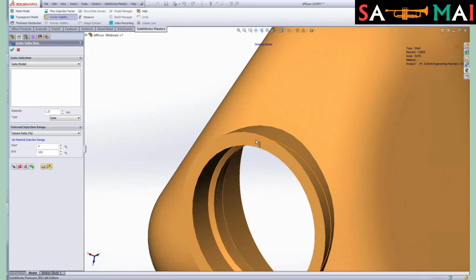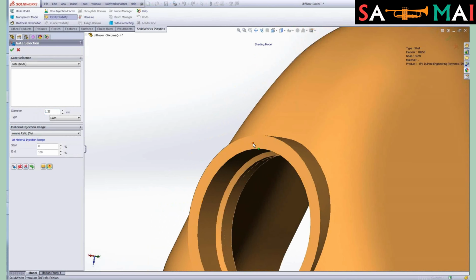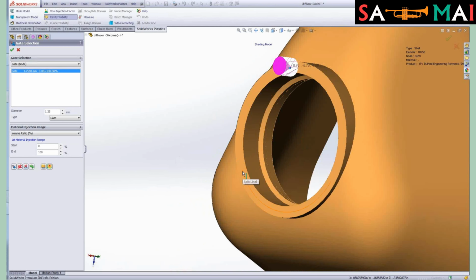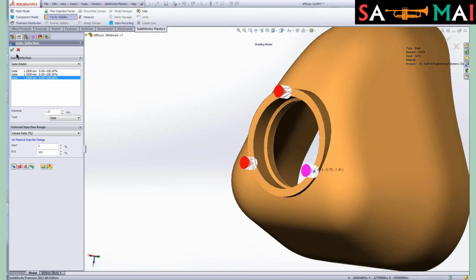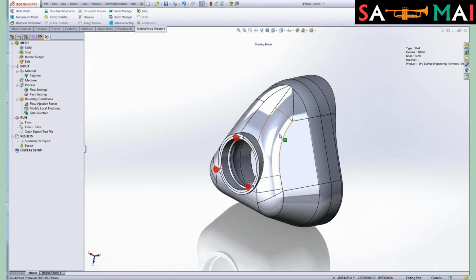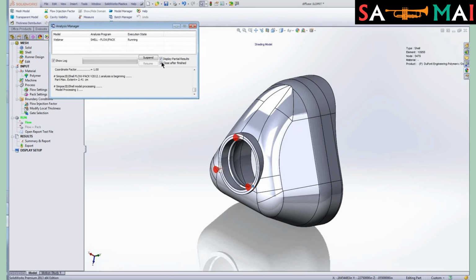So what I'm going to do is zoom in on the part here. There's 1 gate location. There's my 2nd gate location. And here's my 3rd gate location. And that should be it. So let's go ahead and analyze the flow into this particular model with 3 different gates.